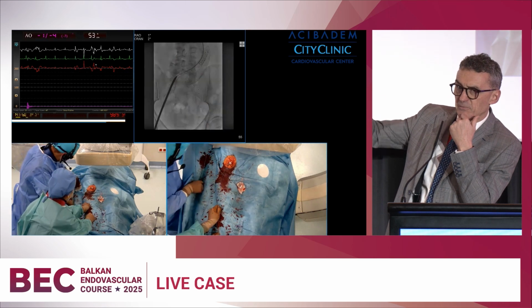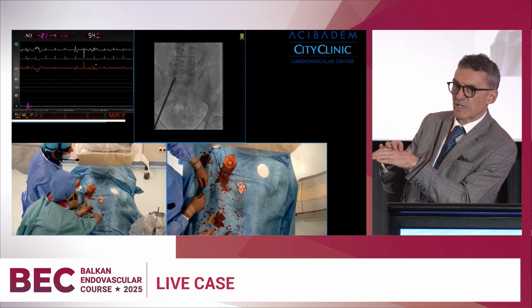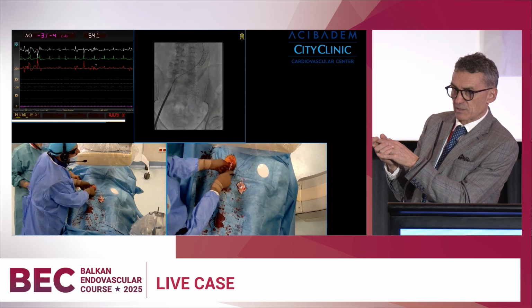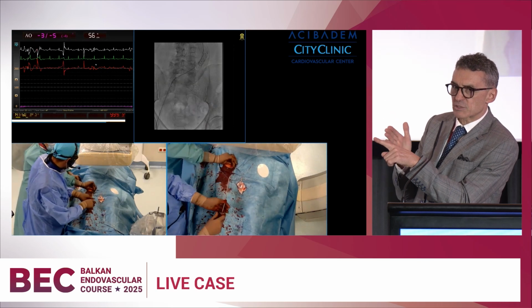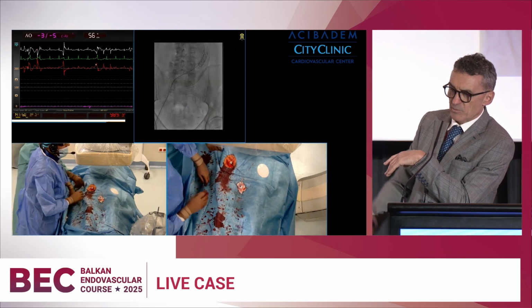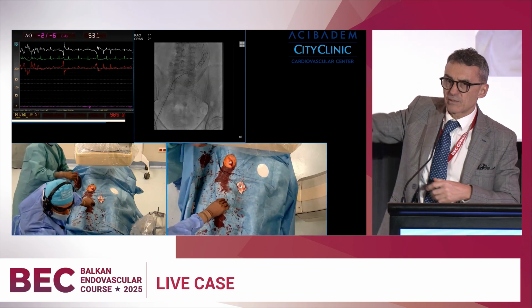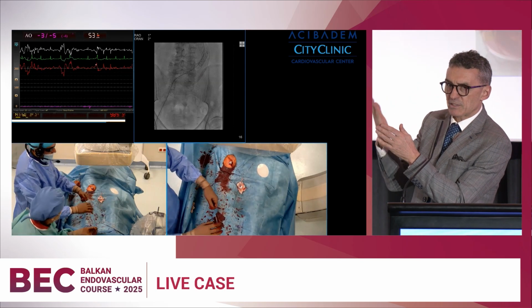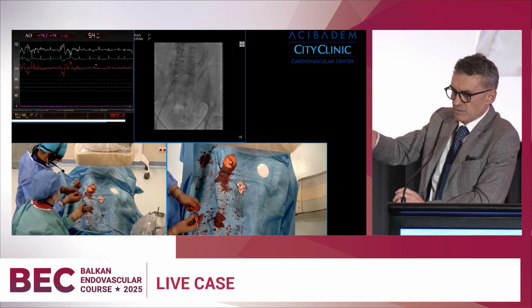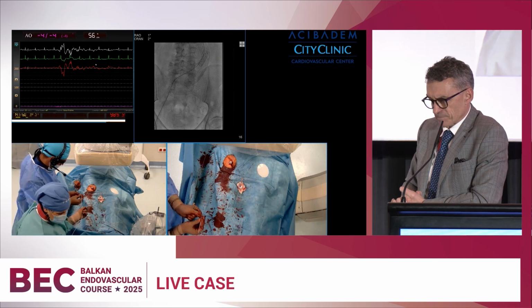So the catheter from above is playing the role of protective sleeve of the wire, because the catheter is not aggressive, but the wire can cut. It really can cut tissues. So in order to protect the tissues in all this tortuous anatomy, because when we straighten the anatomy and we move the wire, the wire can literally cut. To avoid this, the catheter from above is playing the role of protective sleeve of the wire.